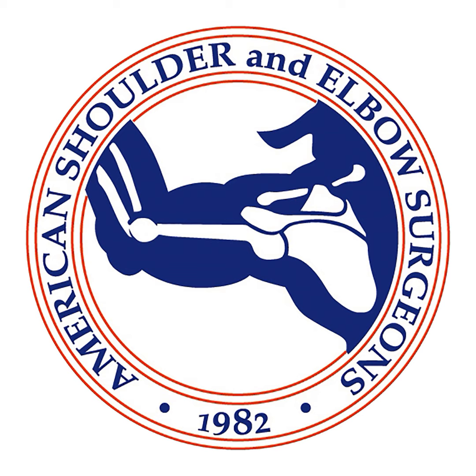I think it's interesting, Rachel. I think that over time the advantages that we've seen have been published. So bone preservation, lower risk of intraoperative fracture, less blood loss, less pain. I think stemless, again, for me, is really preferable that way.